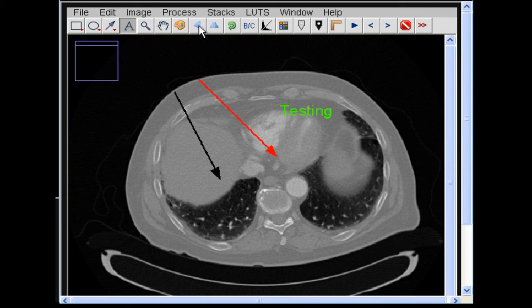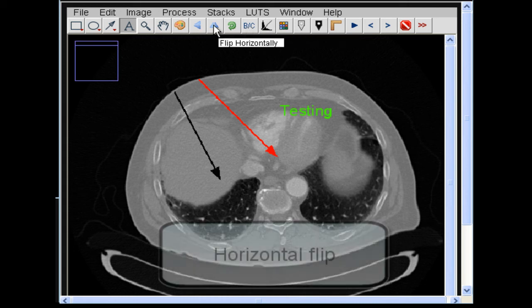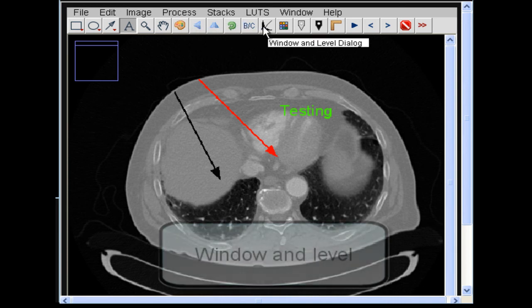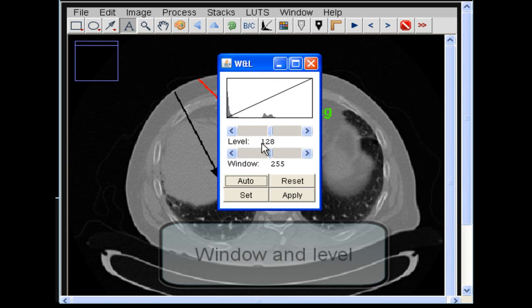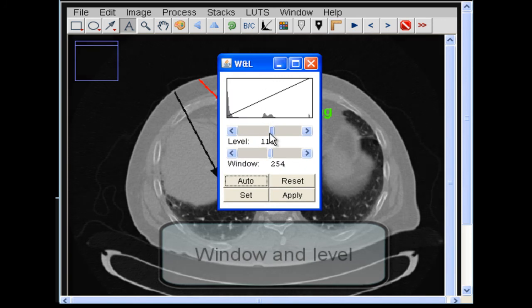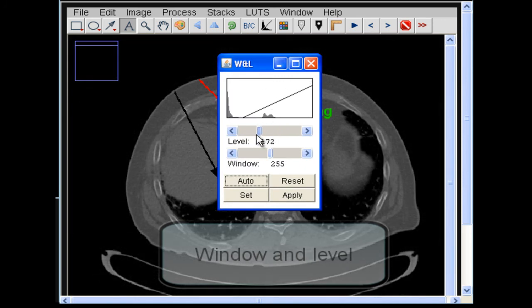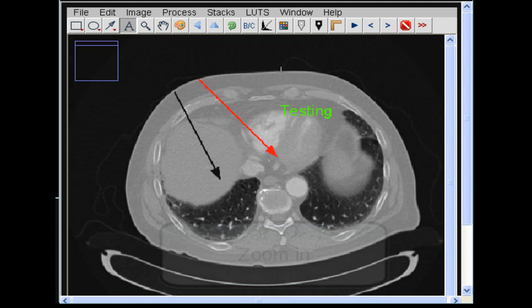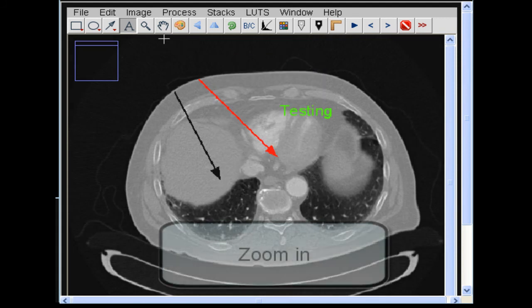A range of transformations are possible, including flipping the image, window and level, and zooming.